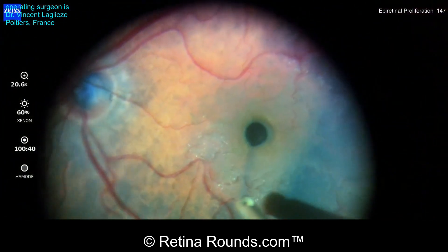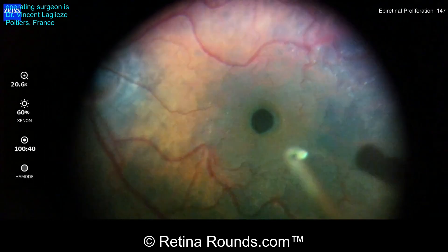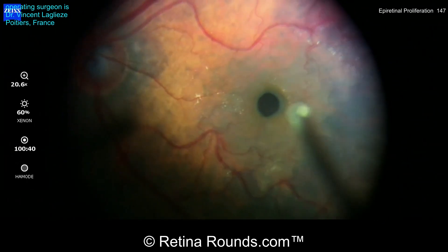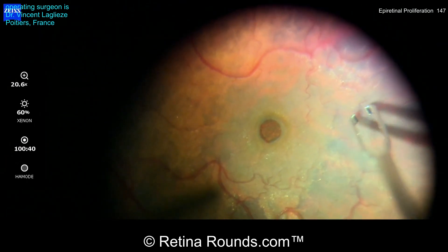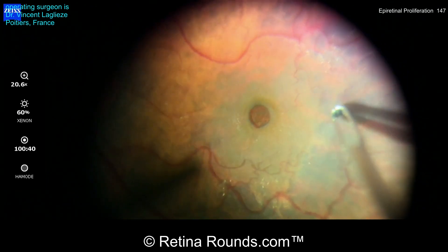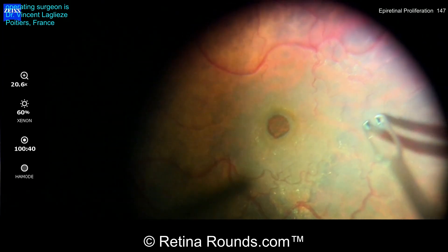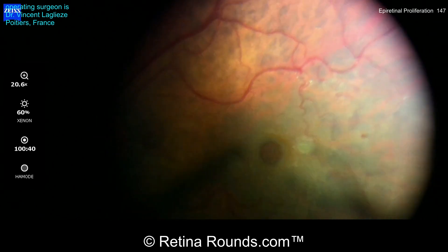Now we're getting a higher magnification view. The tissue blue is being removed, and you can see that there's some patchy staining of the ILM. The parts of the ILM are going to be blocked from staining due to the presence of this epiretinal proliferation located more centrally. The best area of staining appears to be in the temporal aspect of the macula, and so Dr. Leglaise is going to try to fracture the ILM in this location using a pinch-and-peel technique.